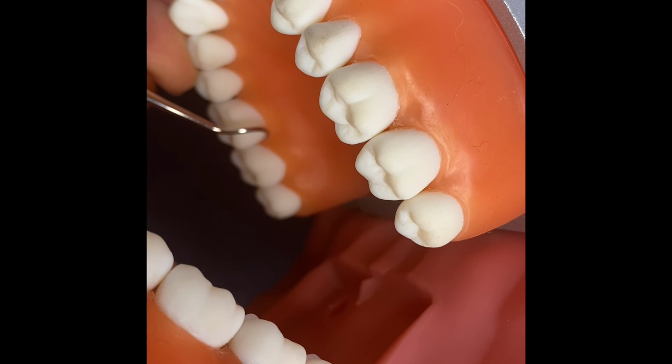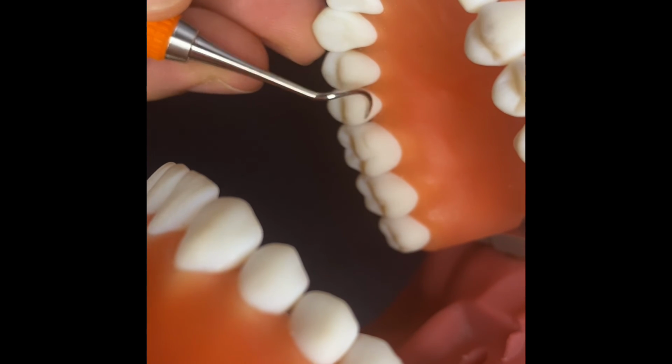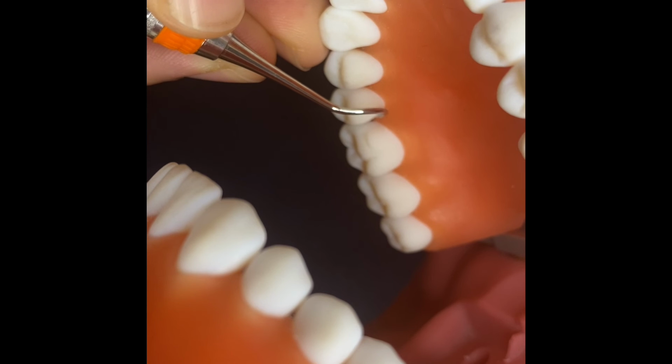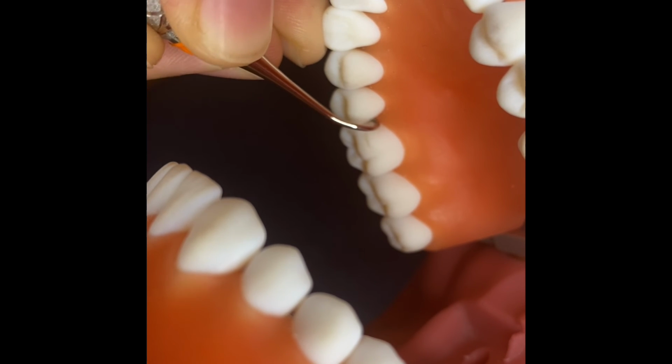Side to side, pivot, roll, up, down, up, down.